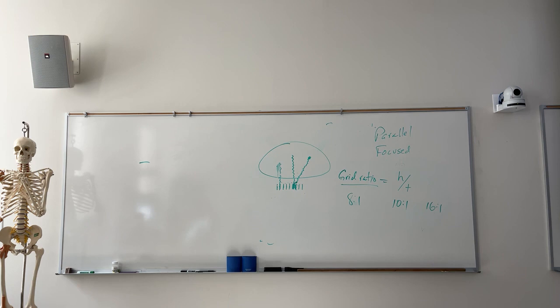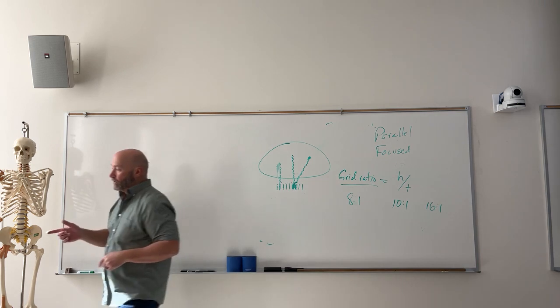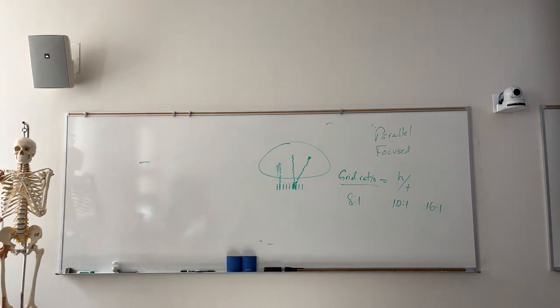Now, notice that it's got 3 different kVps there. So you've got 70 kVp, 90 kVp, and 120 kVp. As we increase kVp, we create more scatter. The purpose for a grid is to absorb scatter. Right. So now what you need to look at is the 120 kVp with a 5-to-1 grid. Let's say we now, instead of using 70 kVp, we use 120 kVp, at 20 mass, and we incorporate a 5-to-1 grid. What's our Bucky factor? What was it at 70? It's 2. What is it at 120? 3. Why?